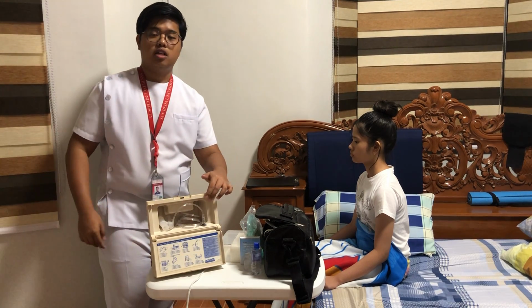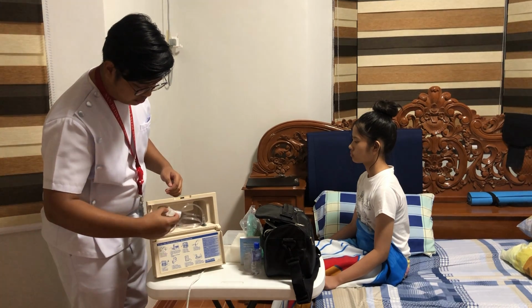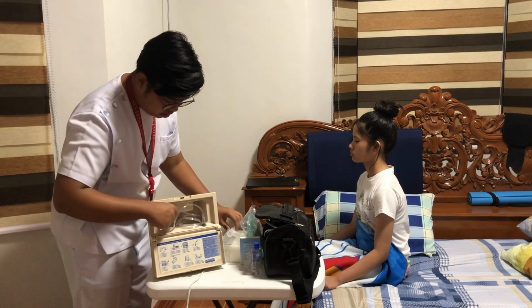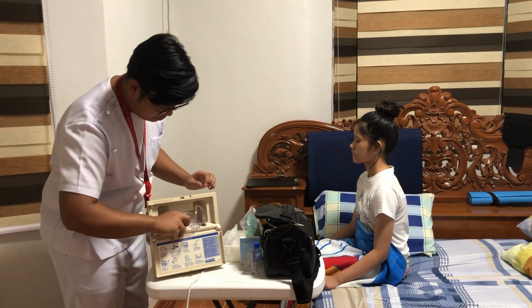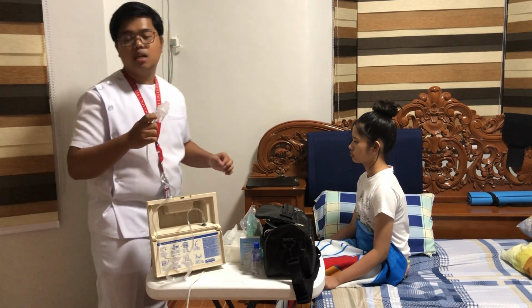Now our tubings are pre-attached, and then we must get the chamber, and we must keep in mind to keep the chamber cup in the upright position.